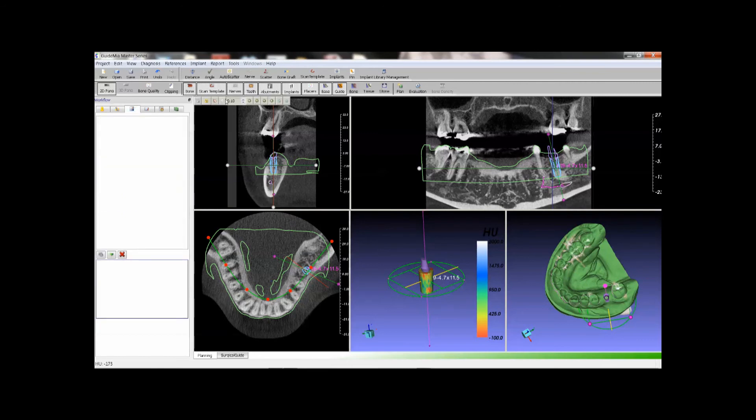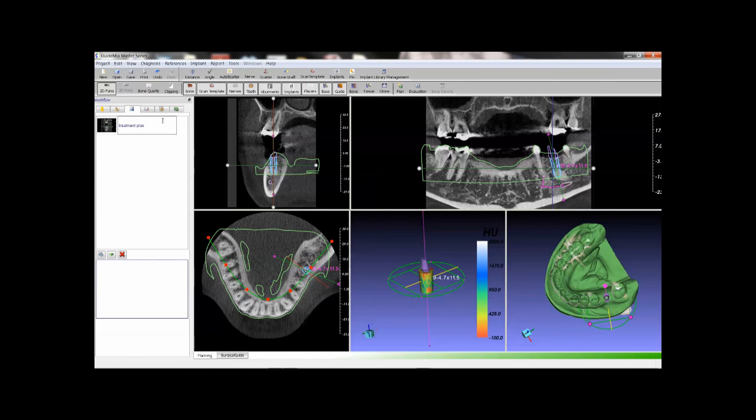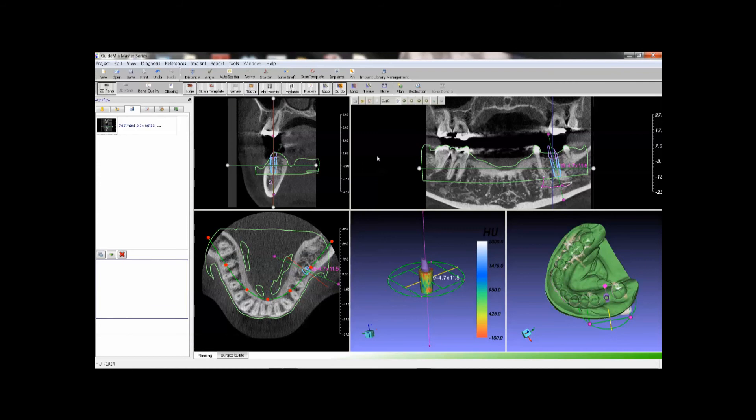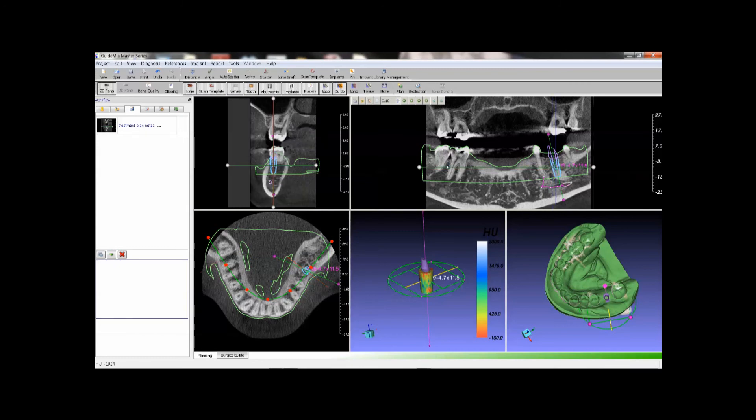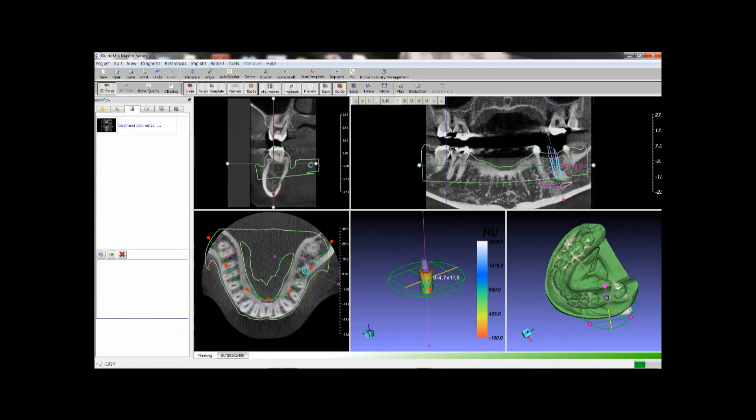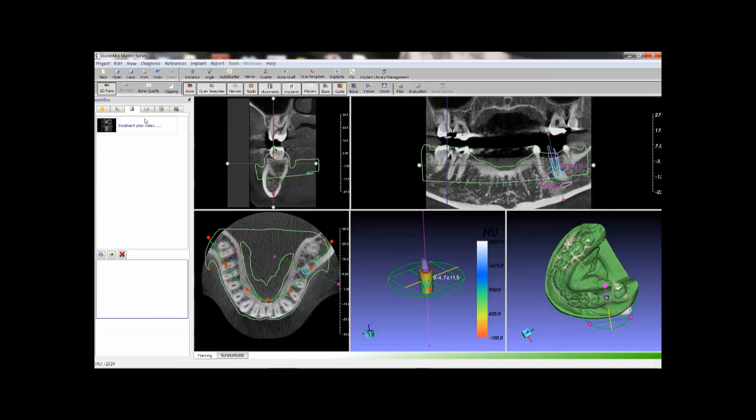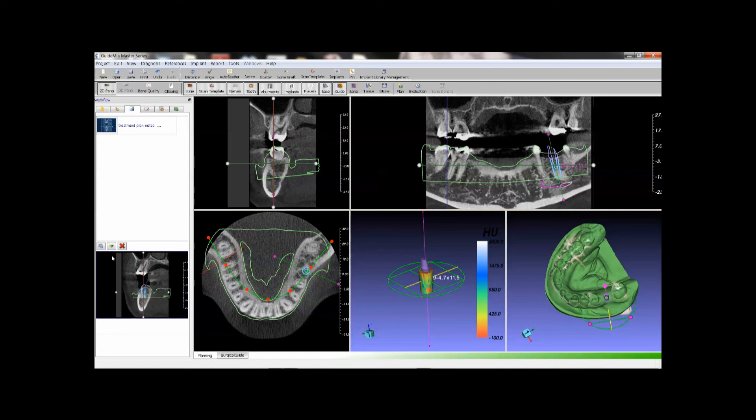Next we will show the tool for diagnosis notes. Click the snapshot icon. The system will capture a snapshot of the window, show it in the navigator. We can then edit the notes. Later or maybe in next session, when you want to review your case, you can just come back to this navigator, look through them, show a preview picture of a snapshot, or double click to make it current. This will bring you to the status you create the snapshot, other than just a static image.